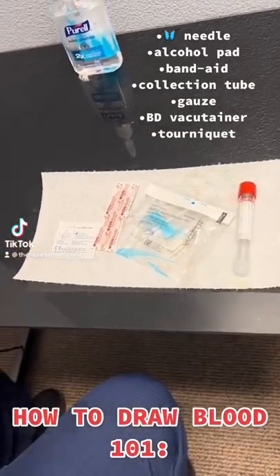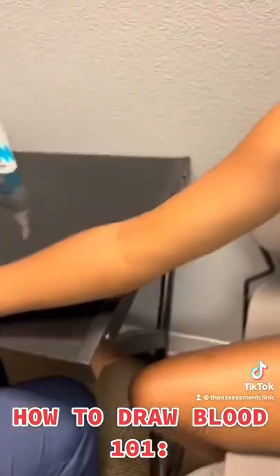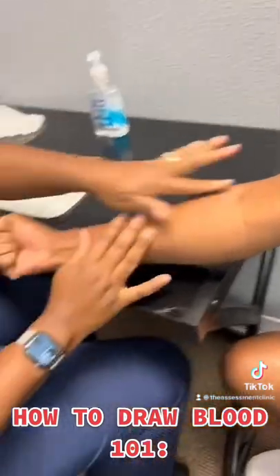Hi guys, we're drawing blood today. Gather your supplies, inspect the arm to find a vein, apply the tourniquet, then find the vein again.